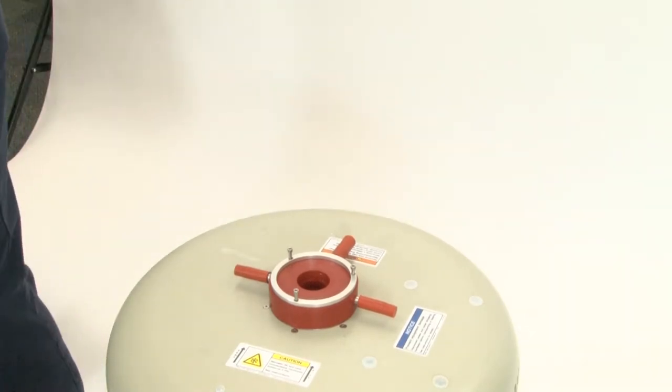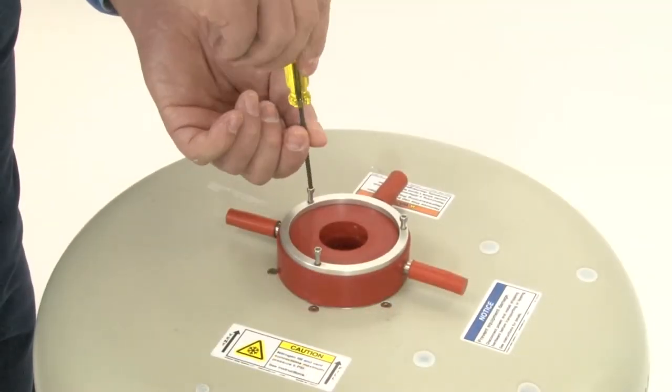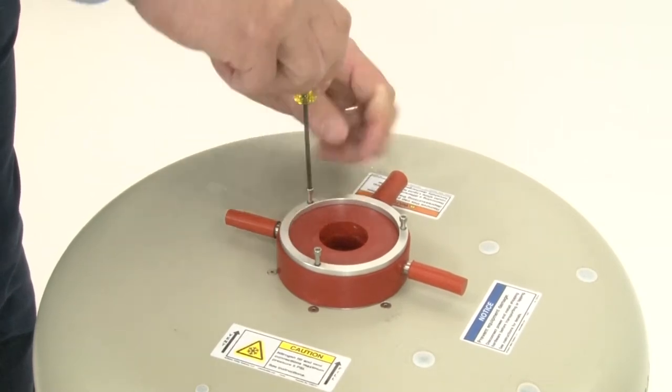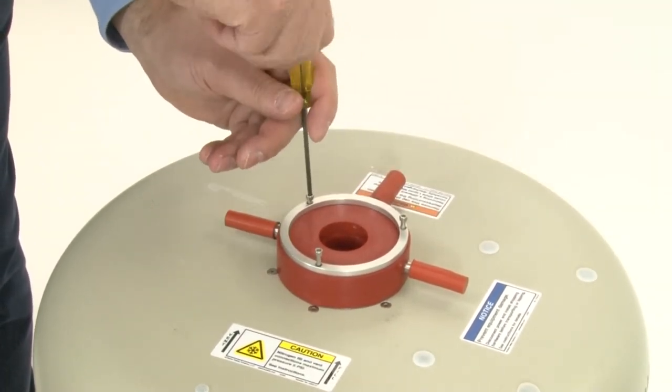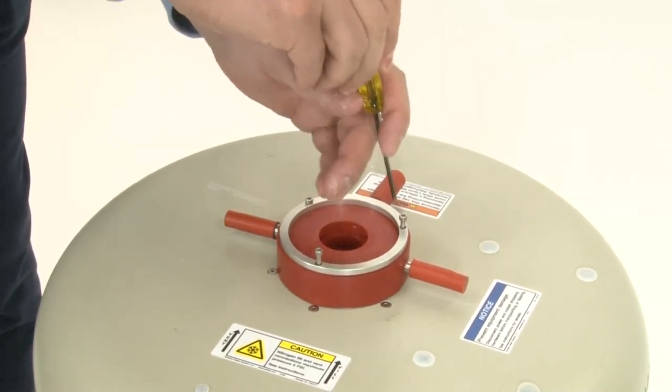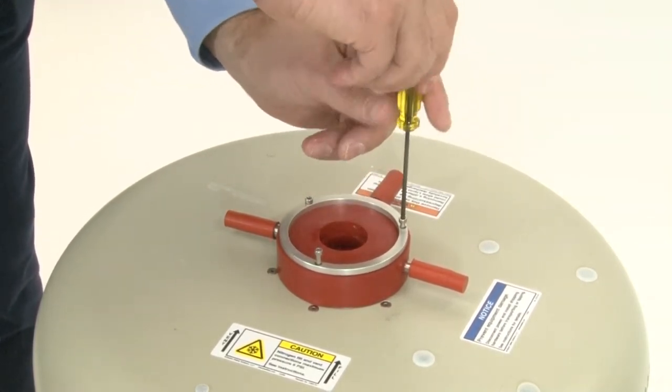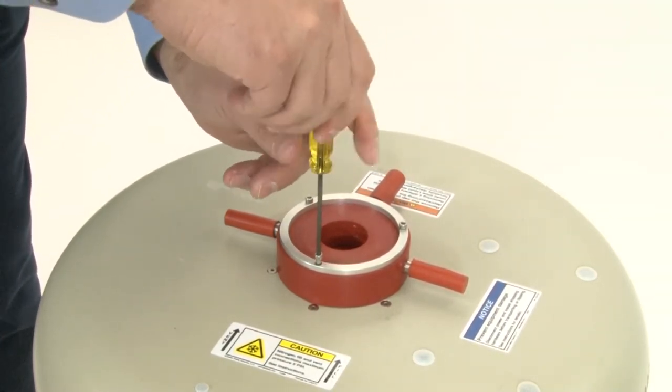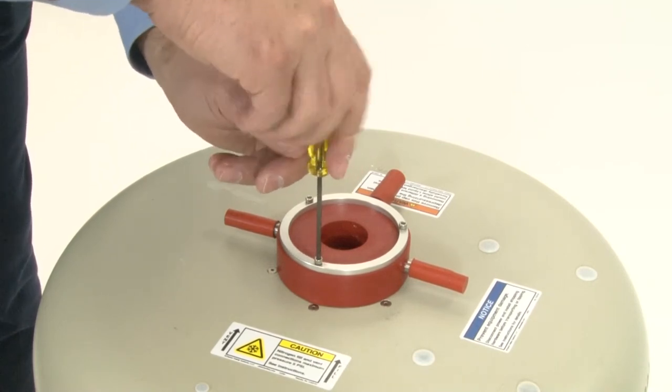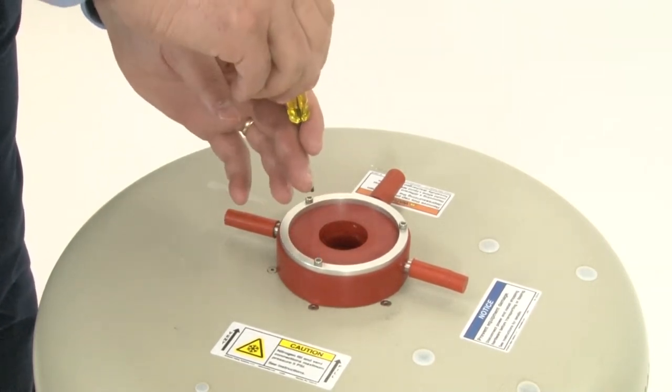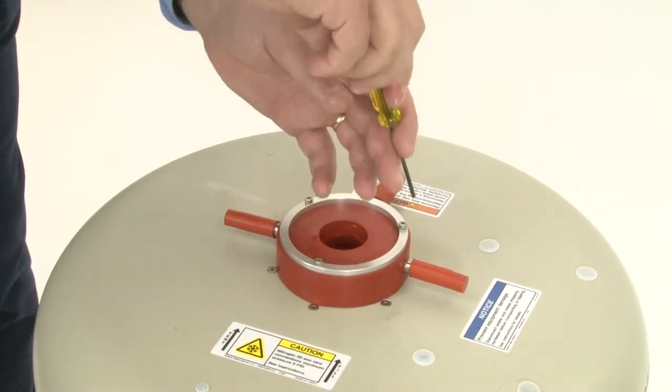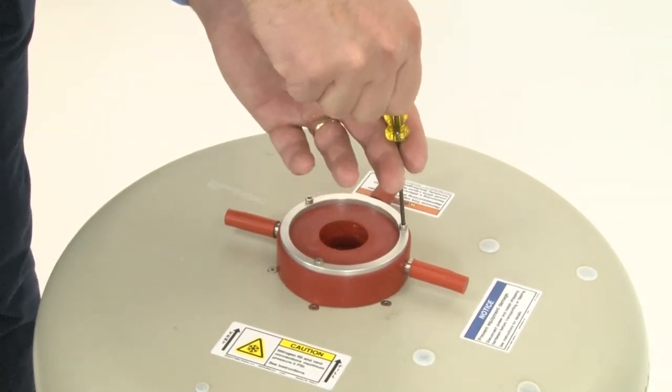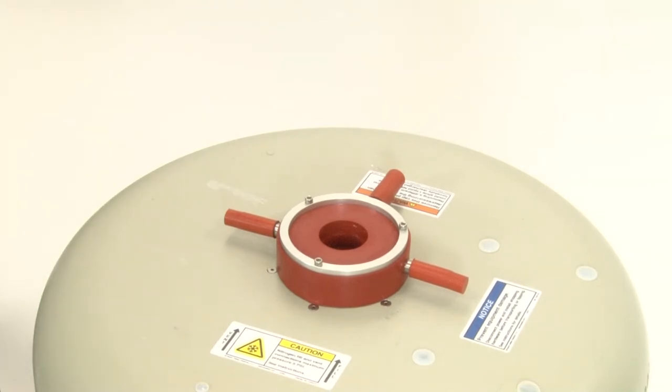So we put that down. We take our 7/64th Allen hex wrench and we screw down our three screws. Screw them all until they just touch the top of the mounting ring. And then go back and tighten them down. Tighten them down hand-tight. It is possible to over-tighten the collar. If you tighten it too tight, you'll deform the collar and make a potential leaking path. So hand-tight is all you need to do. So that's the collar. The collar is now properly installed.